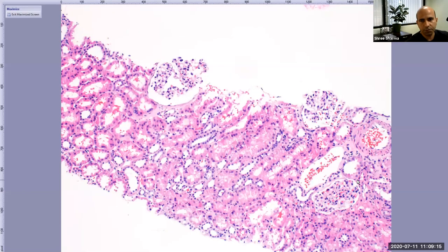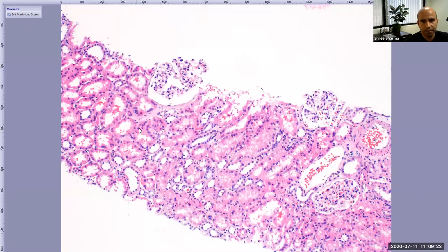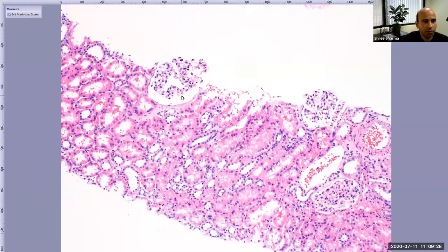At this power you can see the round structures I was showing you and a bunch of tubular structures. They can be cut longitudinally or horizontally. These round structures are known as glomeruli — if I'm talking about multiple glomeruli, I'll use the word glomeruli.